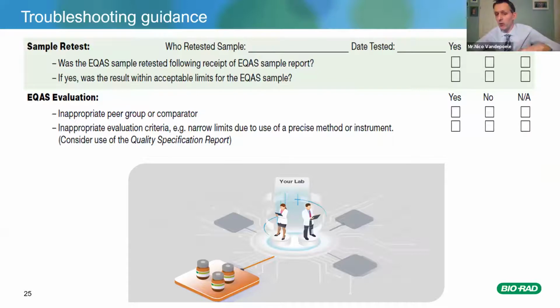Be careful, always check the insert of your material, because some samples, like blood gas samples, you are not able to store until you get the results back. A blood gas sample, you have to open, run right away, and then discard, because 2 or 3 hours later, these results will not be the same anymore. For some other chemistry or immunoassay, if you still have some sample left, you could store that. And if a result comes back, you could see if you can repeat it once to see if it would still occur or not.